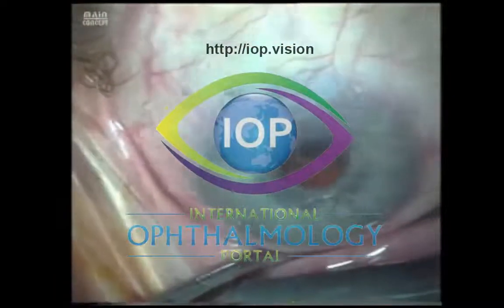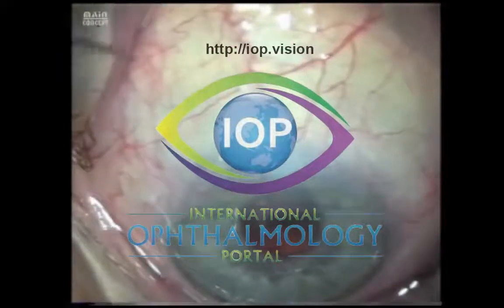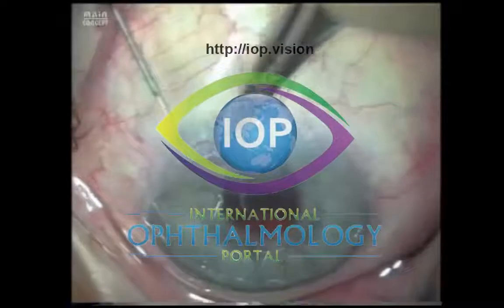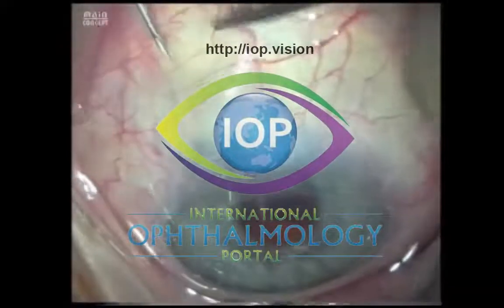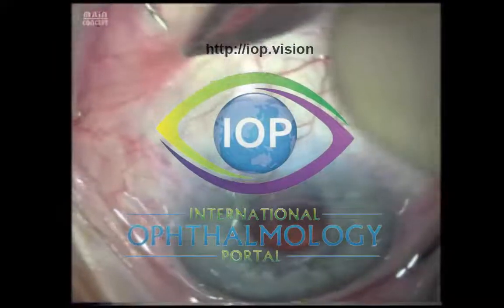I ask the patient to look down and I keep talking to the patient. As with all surgery under topical anaesthesia, it's important to keep the patient calm, and a good steady dialogue helps. The patient is now infraducting.